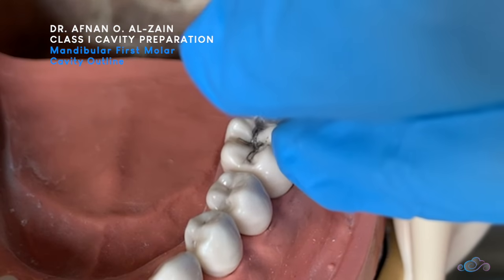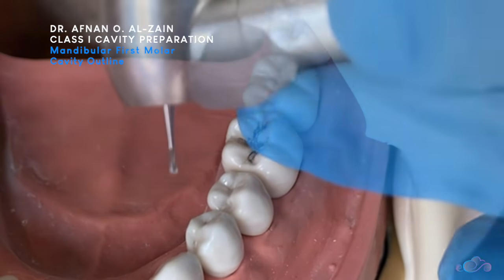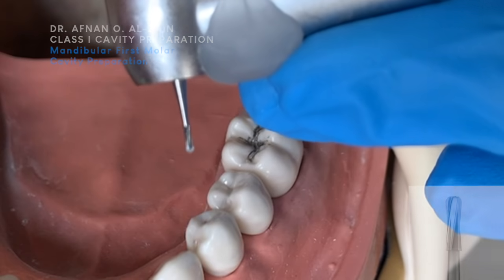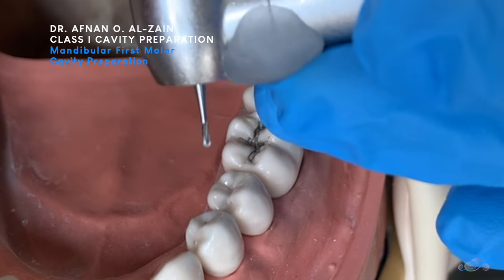First of all, we go to the main groove, then we go to each branch groove. We use the 245 carbide bur. We use this cavity preparation for both amalgam and composite.